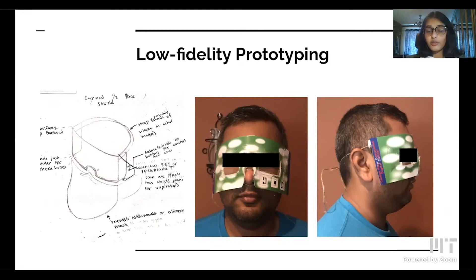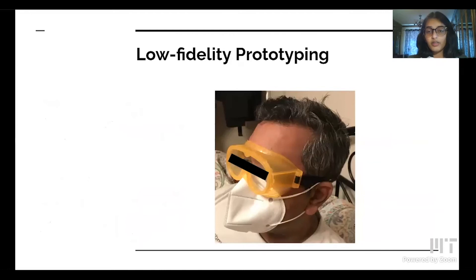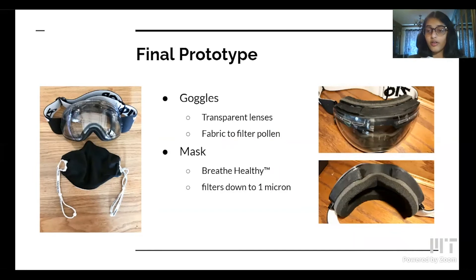I made two low-fidelity prototypes to test my design. My plan for the first was to make my own goggles out of laser-cut polycarbonate. This prototype revealed the importance of ensuring proper fit for any pair of goggles. After making this prototype, I received feedback to look into commercially available goggles. My next low-fi prototype tested this concept and revealed that pre-made goggles, if modified, would meet my co-designer's needs. Using that concept, this is my final prototype: a reusable mask that filters air down to particles one micron in size, and ski goggles modified with fabric to block all pollen and slightly trimmed foam to improve visibility especially when looking down. Here are a few images of my co-designer wearing the product, along with a video of this product in action.